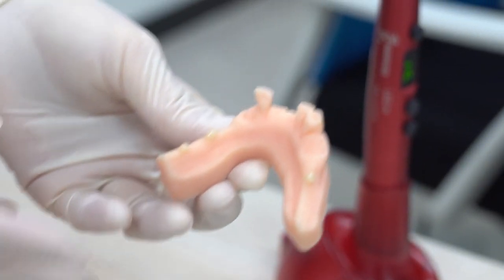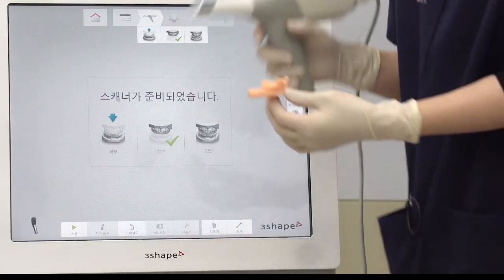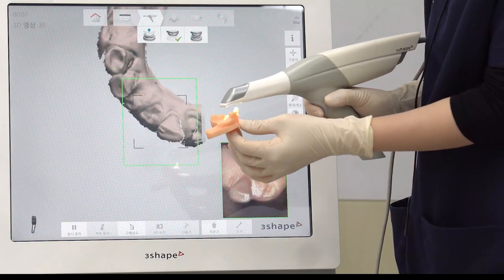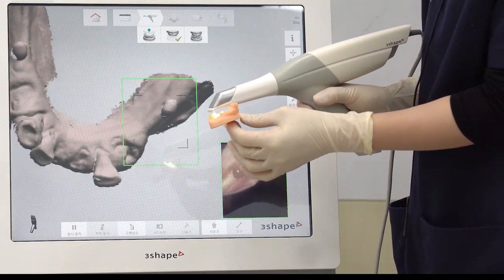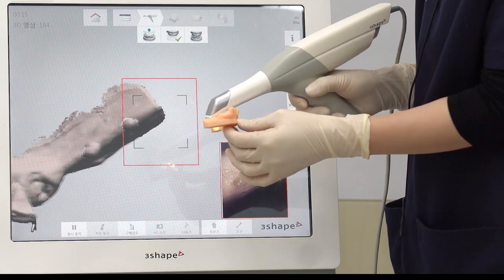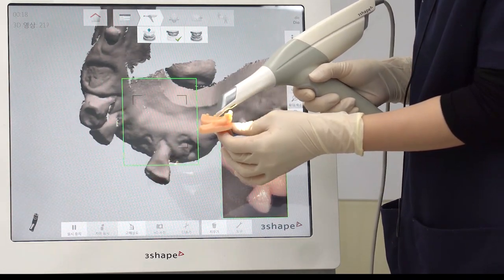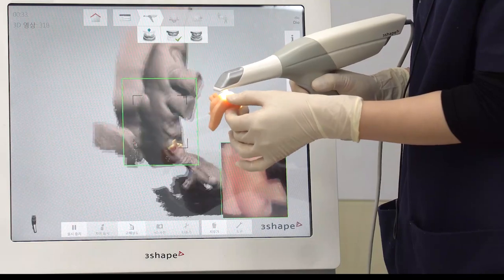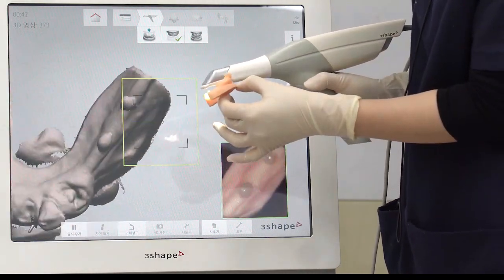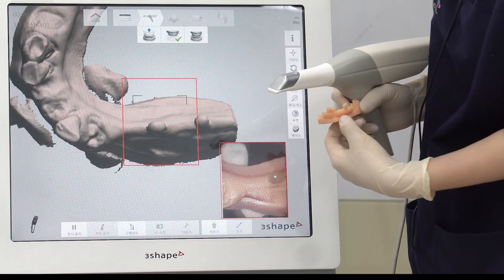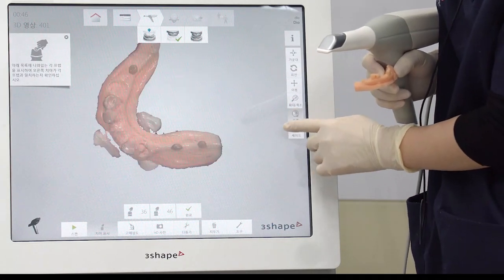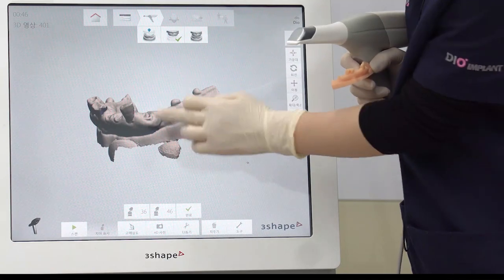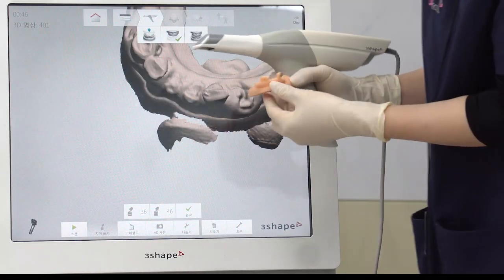After the resin is attached, start scanning the implant location. We will start with the posterior. Be careful so that the resin doesn't come off and slowly move to the wrinkle area. Press the surface button to check the scanned area, and if there is an area that is not scanned, click on the area and start scanning again.